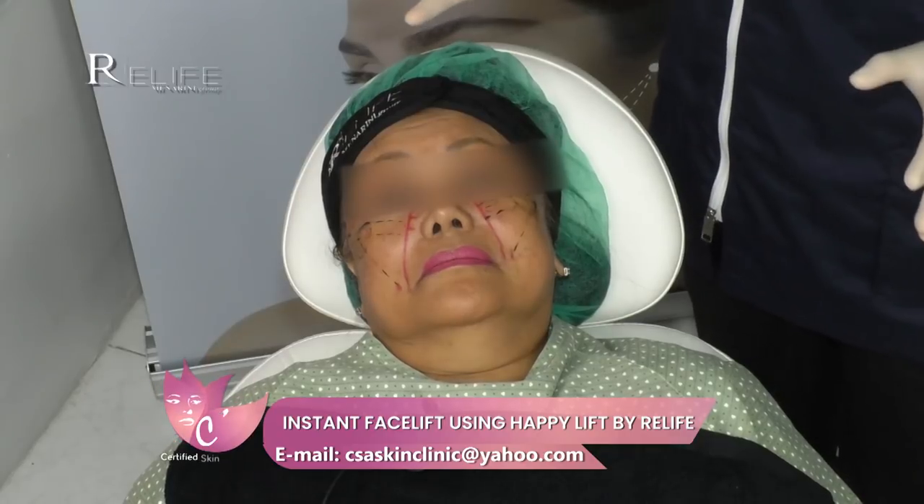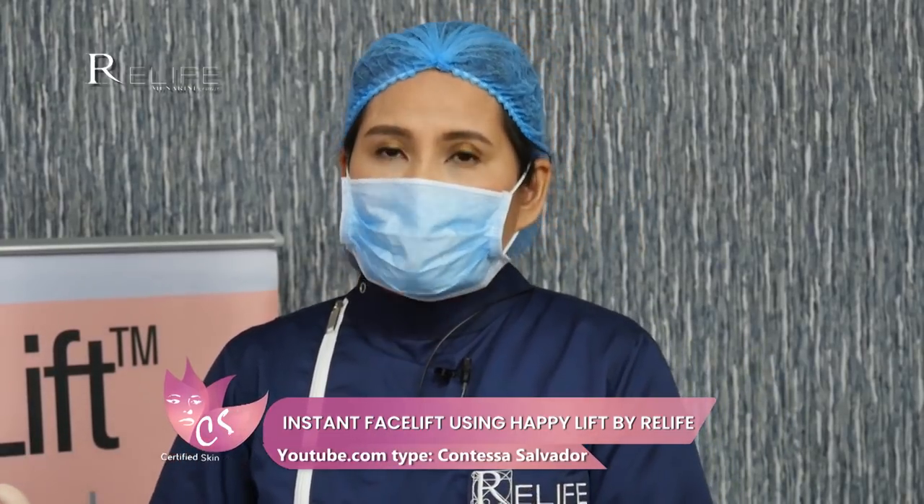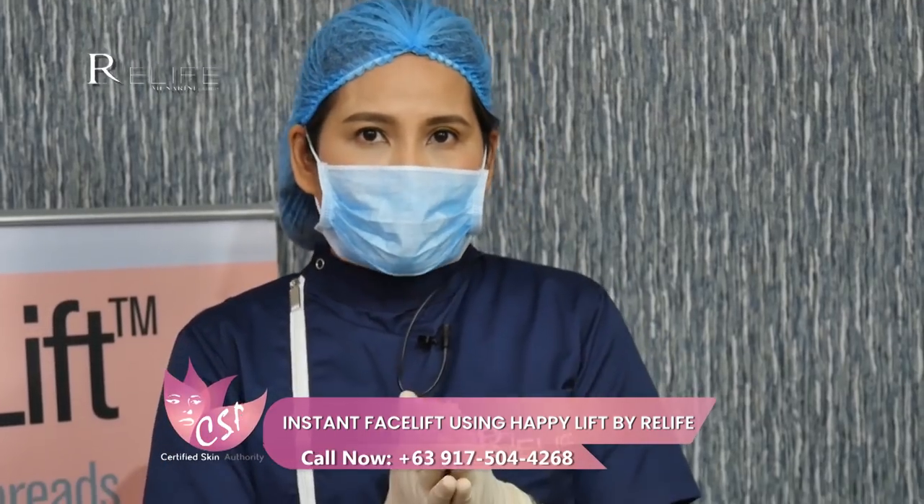I have seen patients aged 60s and above with much more severe sagginess. With Ma'am Reza, I could say the sagginess is not that severe, so we can still do a lifting using our revitalizing threads — a non-surgical approach.